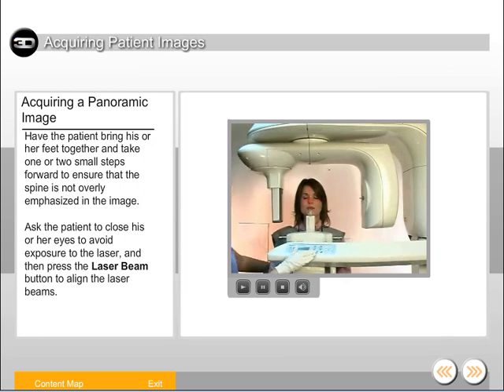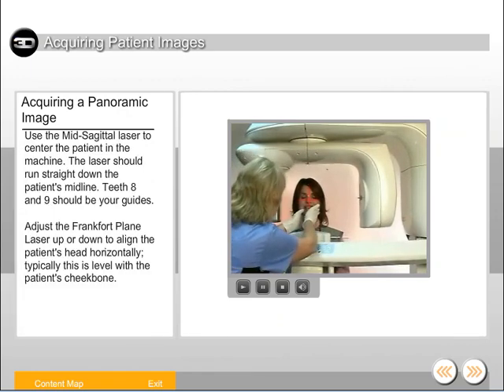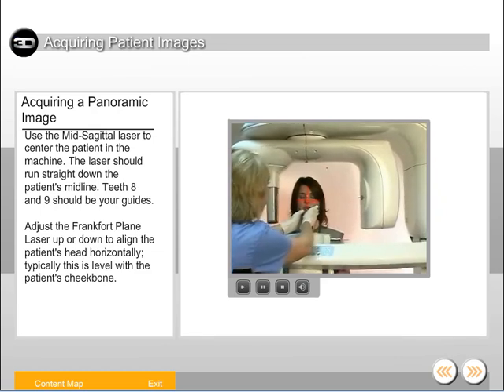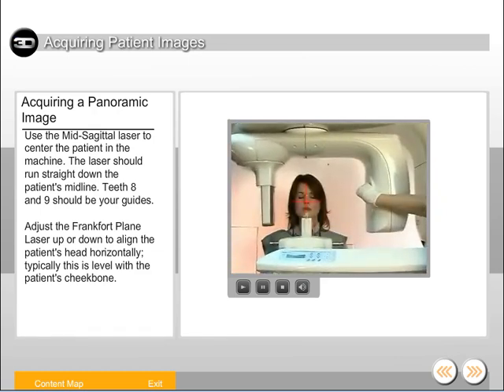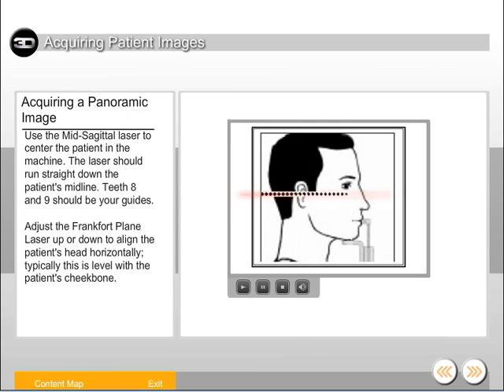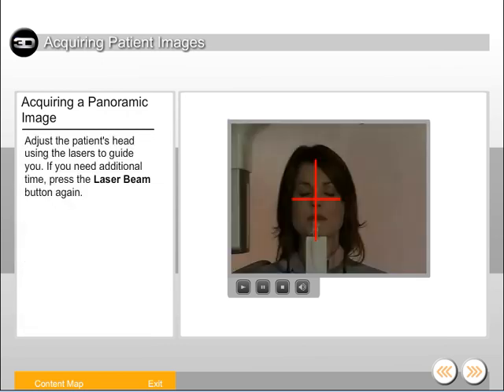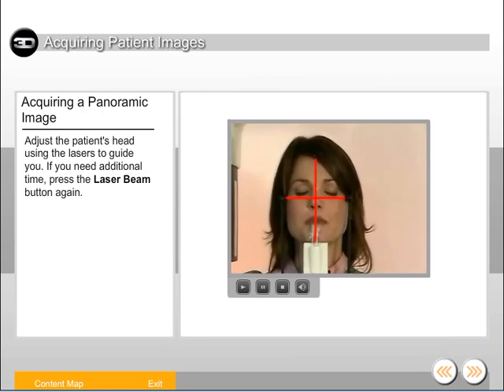Ask the patient to close his or her eyes to avoid exposure to the laser, then press the laser beam button to align the laser beams. Use the mid-sagittal laser to center the patient in the machine — the laser should run straight down the patient's midline. Teeth 8 and 9 should be your guides. Adjust the Frankfurt plane laser up or down to align the patient's head horizontally; typically this is level with the patient's cheekbone. Adjust the patient's head using the lasers to guide you. If you need additional time, press the laser beam button again.